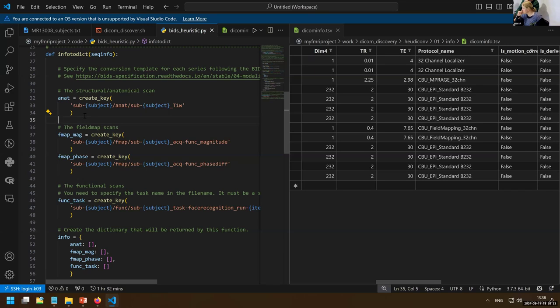If you've got incomplete data sets because you've inherited them from somewhere else, I'm definitely asking for myself, and you don't necessarily have all the information that you require, so the BIDS validator or spec. Is it better to put your data in some sort of incomplete, imperfect BIDS format?